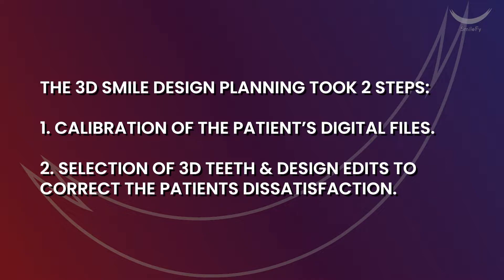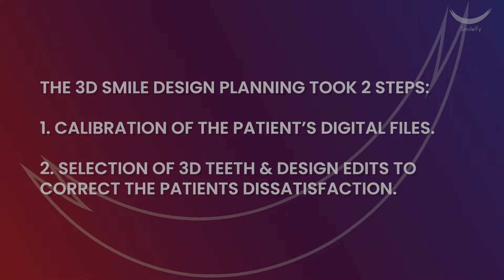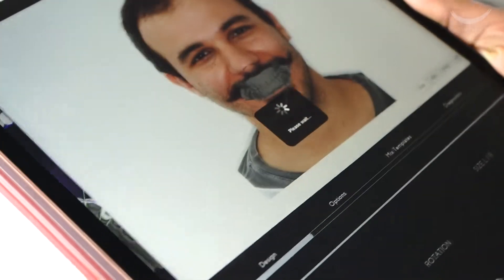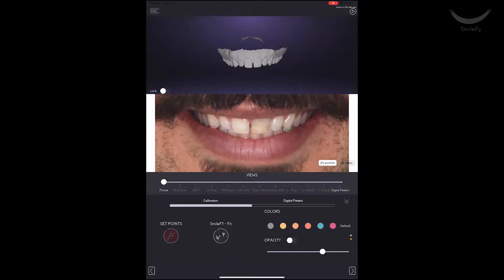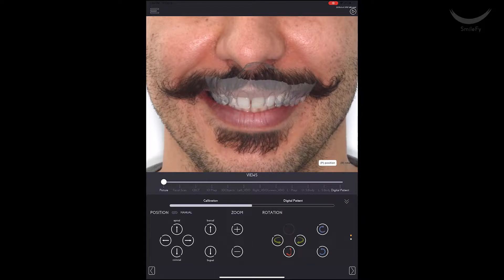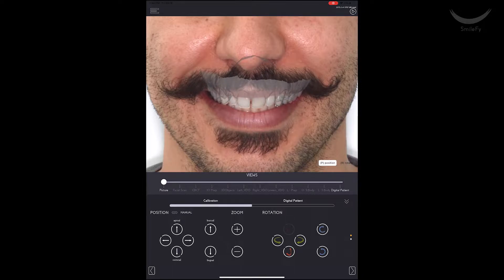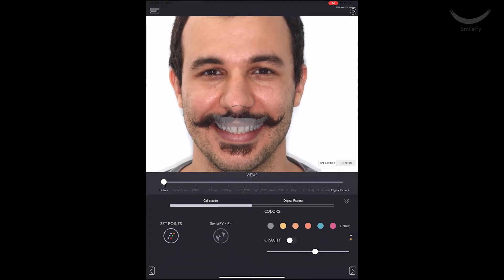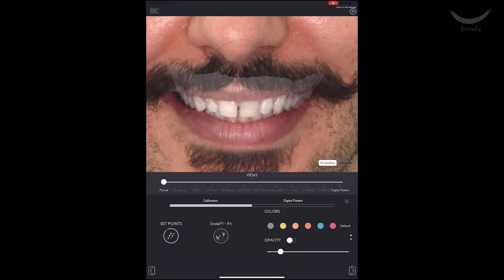The 3D smile design planning took two steps: calibration of the patient's digital files, and selecting the 3D teeth and design edits to correct the patient's dissatisfactions. With the intraoral scan and photo calibrated, I was able to fully visualize the patient's existing teeth. Even though the upper lip was partially covering the cervical margins, with the intraoral scan and photo calibrated together, I am able to visually understand where the margins are and where I should go with my treatment plan.